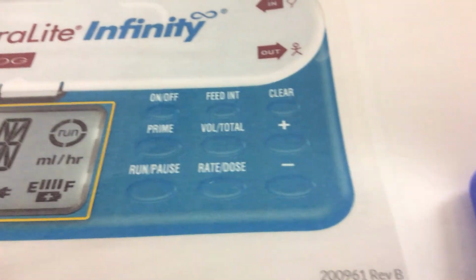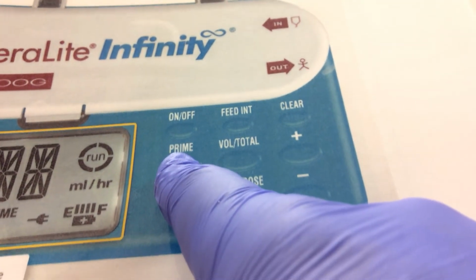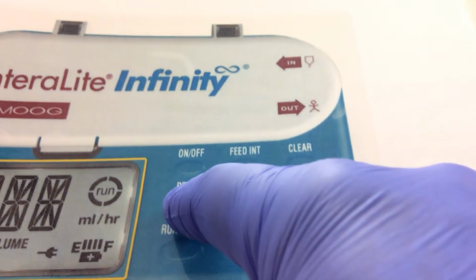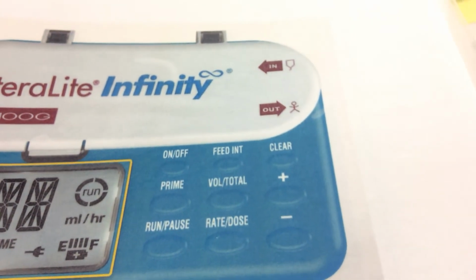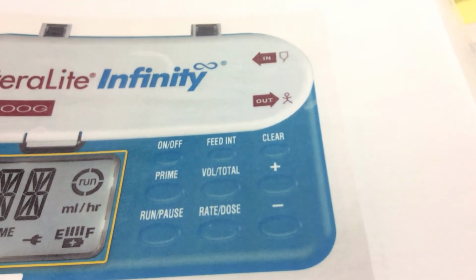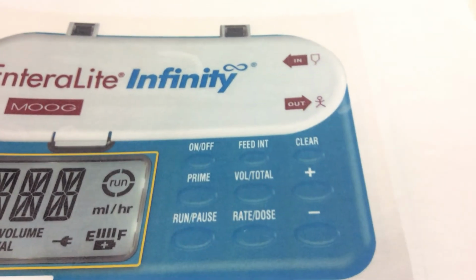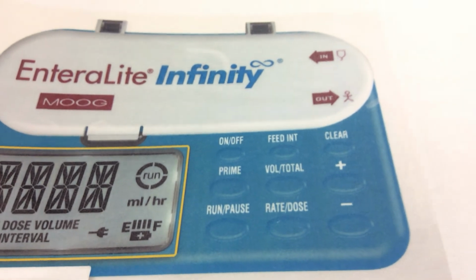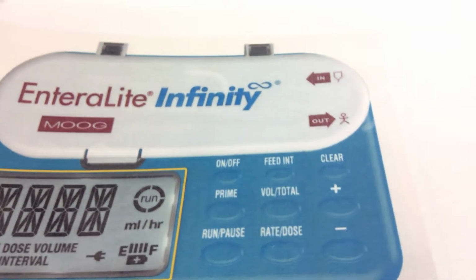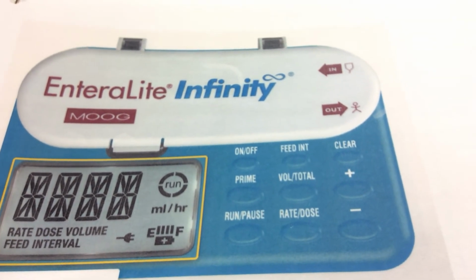Right here, turn it on, and you'll notice that it actually has a prime function right here. So once we have our tubing connected and inside of our pump, we're going to press and hold the prime button, and the pump itself will prime that tubing all the way until the end. So we have primed our tubing, making sure it's in the right place. From here, we are going to set our rate. We'll press there, and we want to make sure that our rate in mLs per hour is matching our physician's orders.